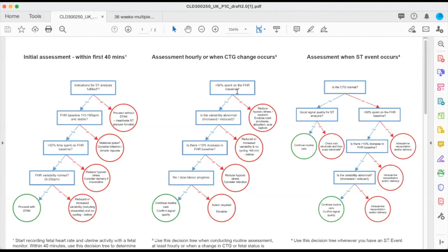If I can see that this baby is well and it's not showing any brain decompensation, I can make sure that this baby remains well throughout the labor. It gives me the chance to actually act and respond to baby way before the emergency is actually happening.